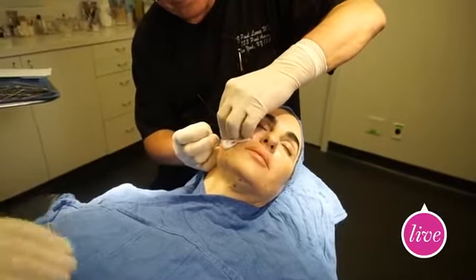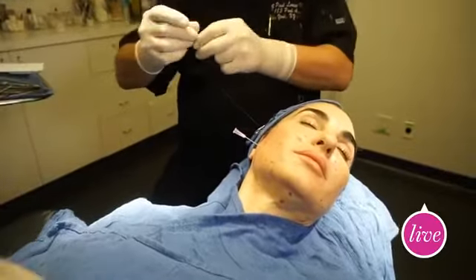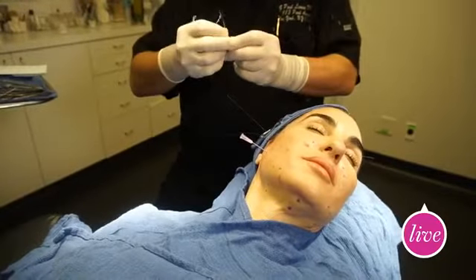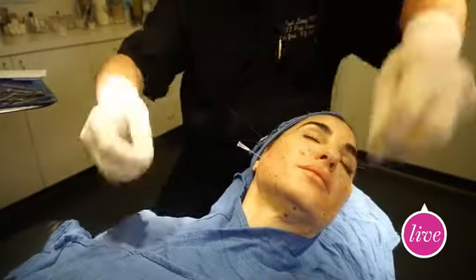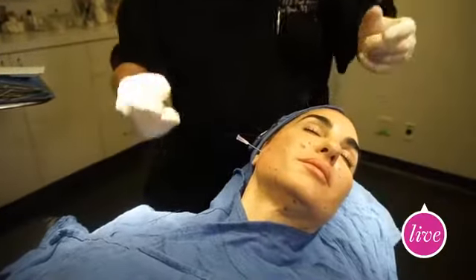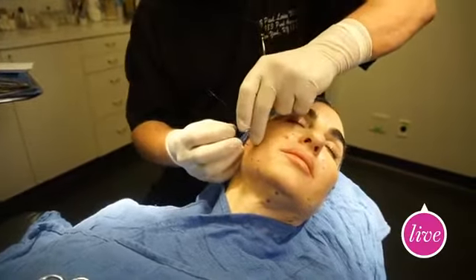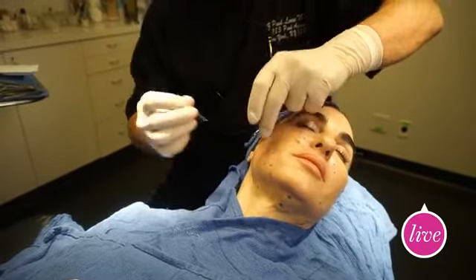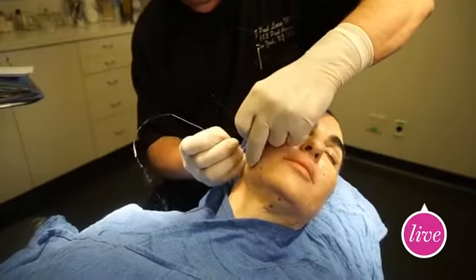And now once it goes in, and then the thread is complete, those threads are pulling the skin up? Sutures, yes. We will set that up. After I complete placement of the sutures on the right side, I will show you how the tissue is advanced. Okay? So right now it's just the placement of the threads. Sutures. Yes. Okay, great.